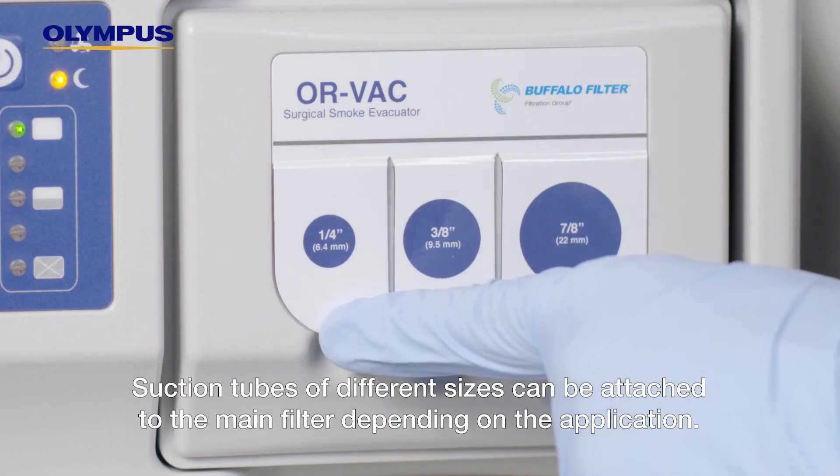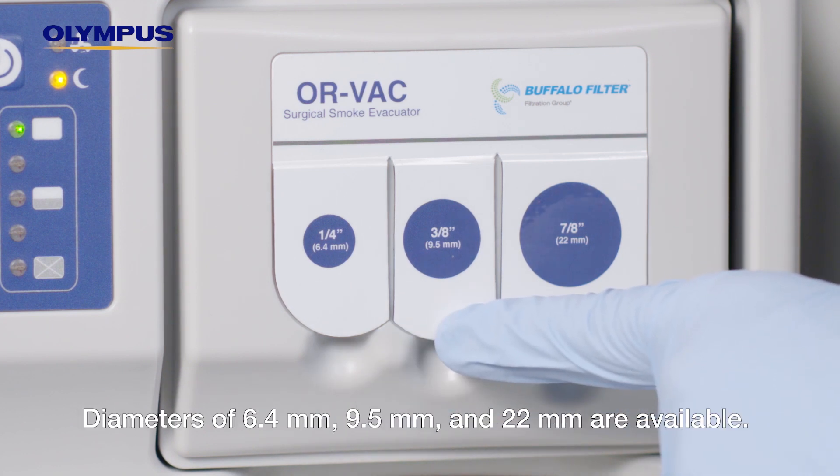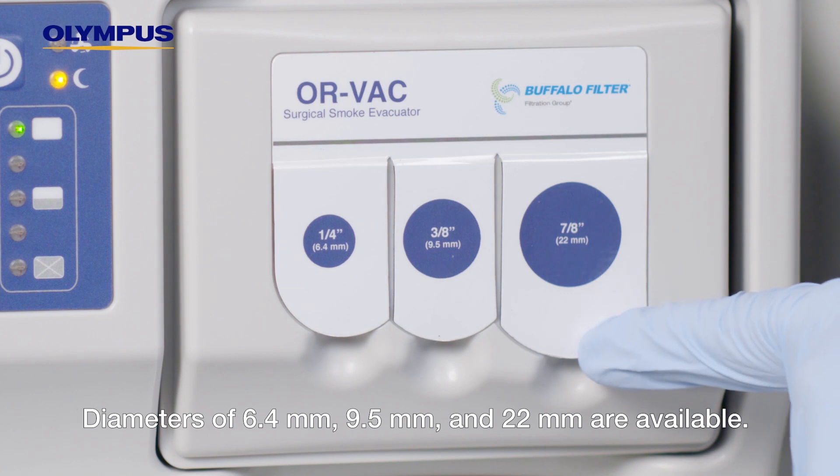Suction tubes of different sizes can be attached to the main filter depending on the application. Diameters of 6.4 millimeters, 9.5 millimeters, and 22 millimeters are available.